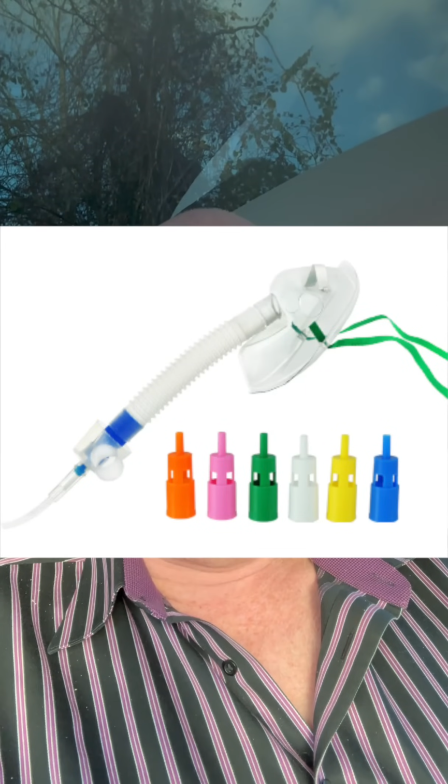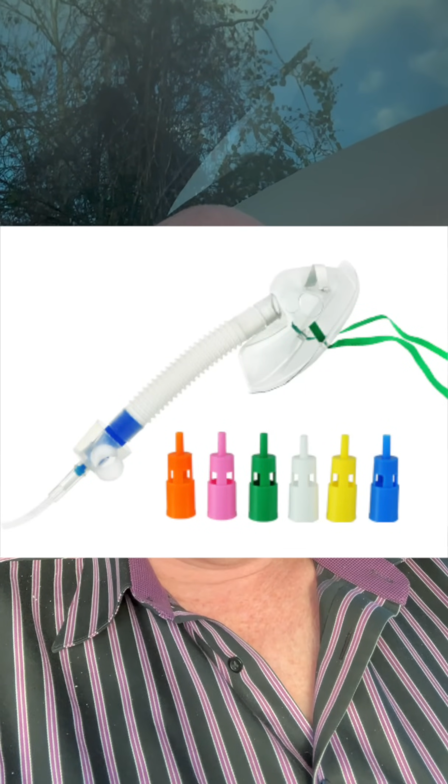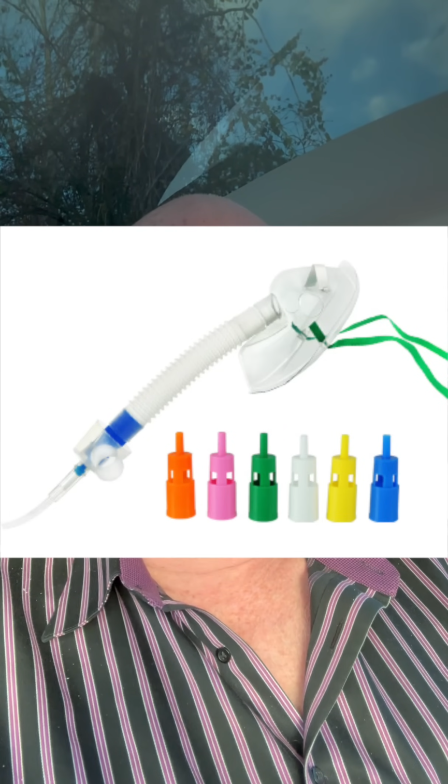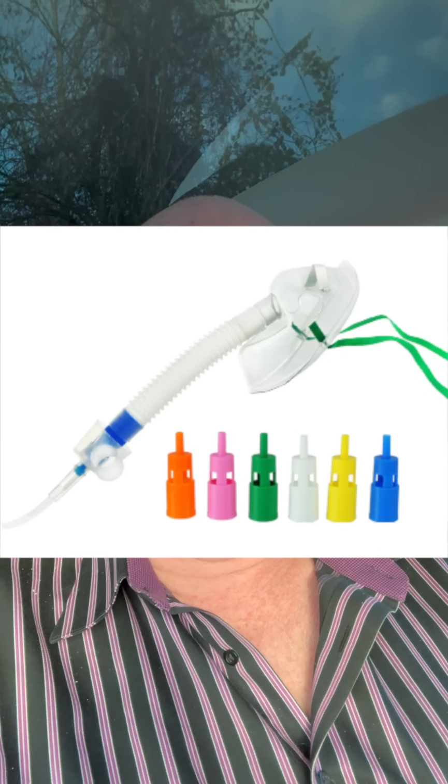So what about Venturi mask? A Venturi mask has a Venturi device that has a nozzle that the oxygen flows through and side holes along the side. That nozzle accelerates the flow of oxygen, causing the Bernoulli effect. You can look that up, but that drops pressure near the air intakes, and air is entrained in and mixed with the oxygen at a fixed ratio. There are different adapters for different FiO2.